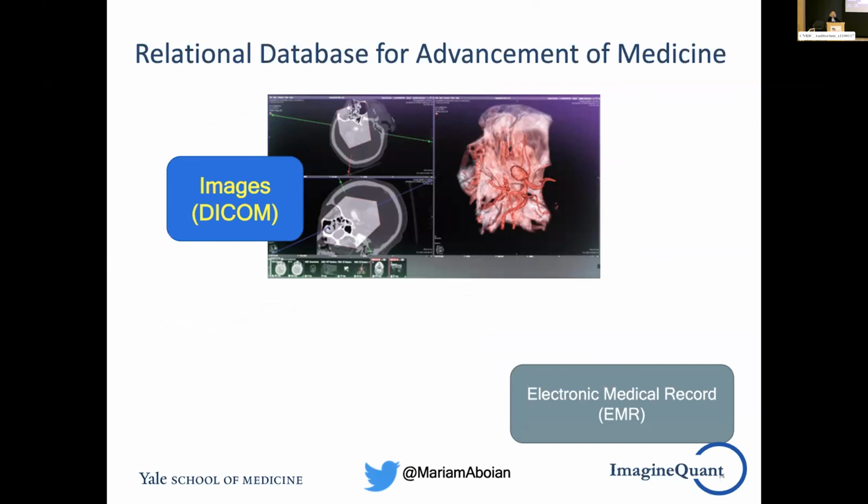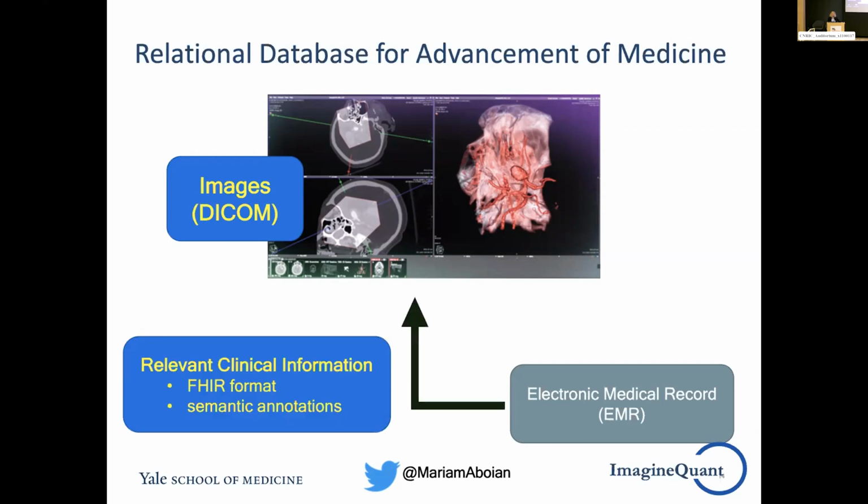We have FHIR forms incorporated into our PACS. So the idea is to take your images and to actually pull the data from the electronic medical record, or actually modify your own data and basically link it so that your DICOM data is now talking to your EMR data. It's possible. I'm having trouble publishing that paper, so I would love your advice. JAMA did not like it.